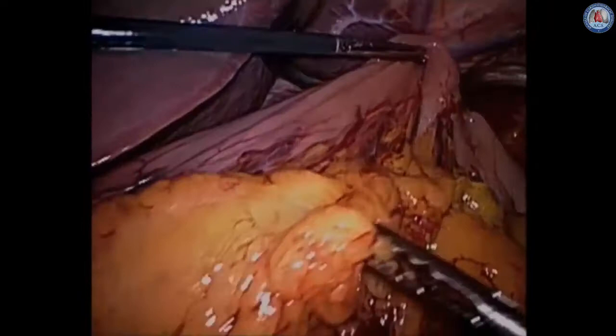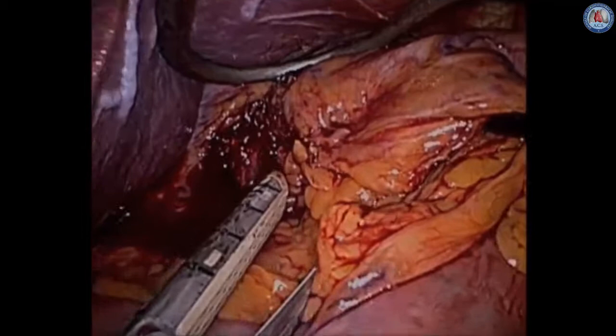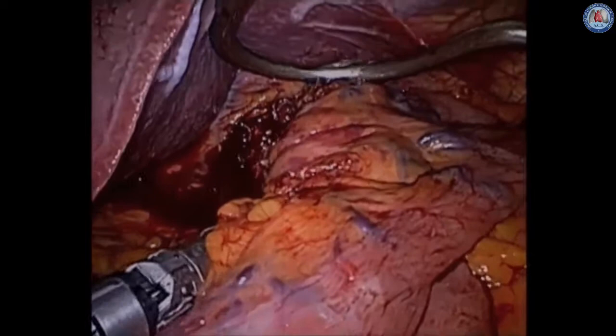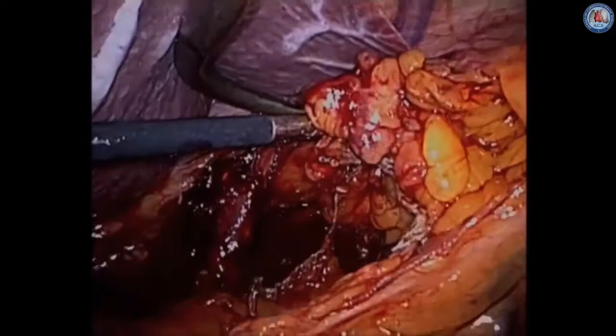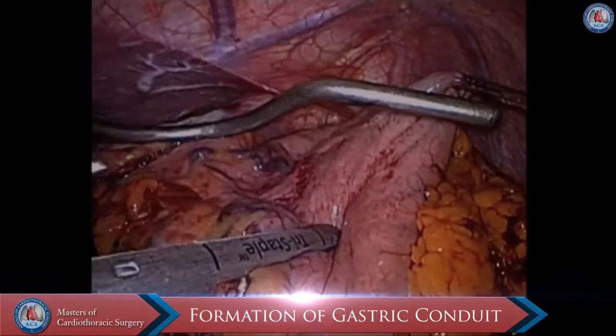We can, if desired, skeletonize this area. We make sure that the gastroepiploic arcade is preserved all the way down to the gastroduodenal area. We then take a vascular stapler and place it along the base of the left gastric artery, making sure we take all the lymph node tissue with us, extending it up into the hiatal opening, and then begin to form our gastric conduit, starting with division of the lesser curvature vasculature.